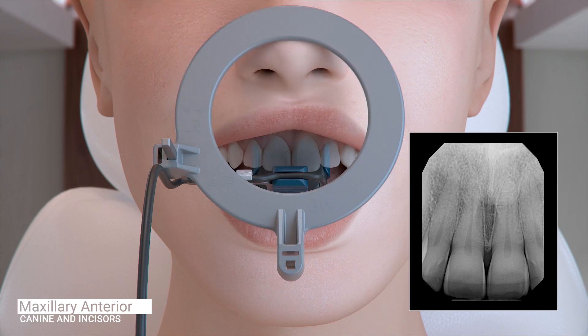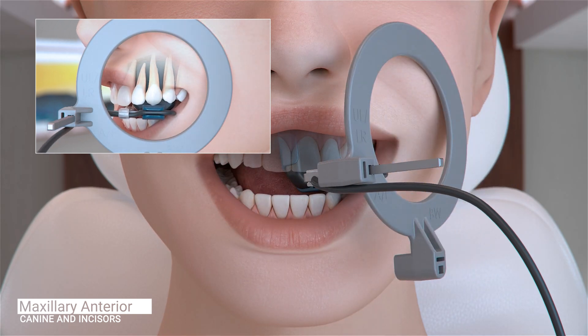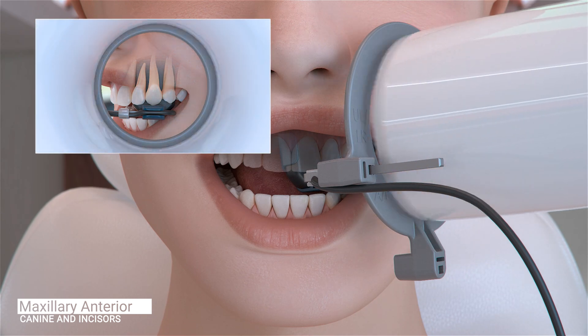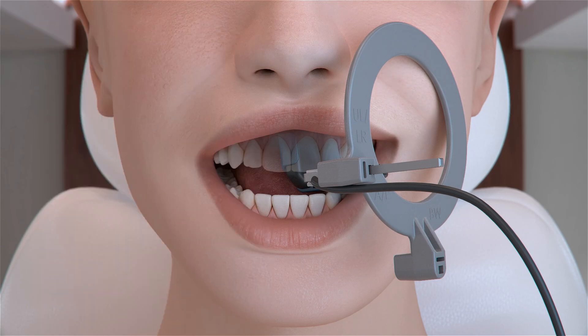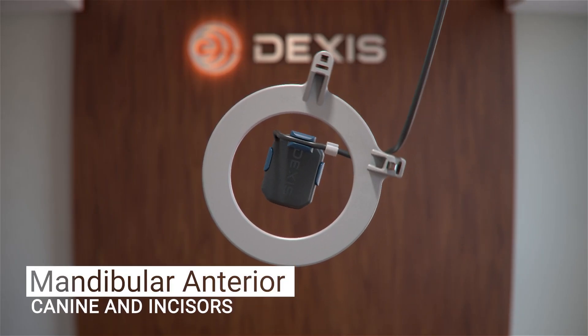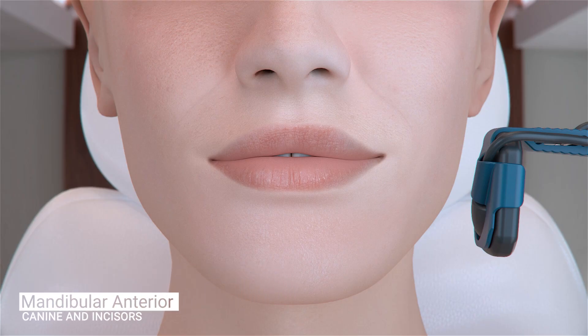Ask the patient to open slightly and reposition the sensor to the left canine. Position the sensor so that the canine is centered on the sensor and is well into the palate and parallel to the long axis of the tooth. Ask the patient to close and slide the aiming ring as close to the patient's face as possible. The cone of the X-ray emitter must be placed flush with the aiming ring and then trigger your exposure. The configuration of the sensor and holder does not have to be adjusted for the next set of images, which will be the mandibular anterior canine and incisors.